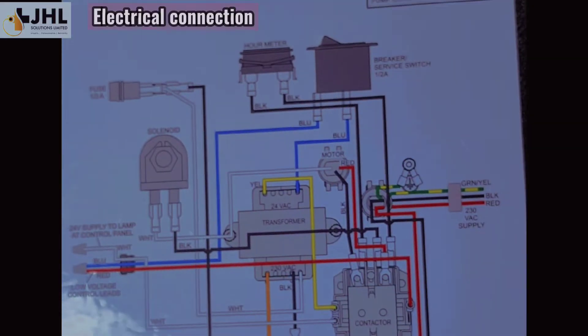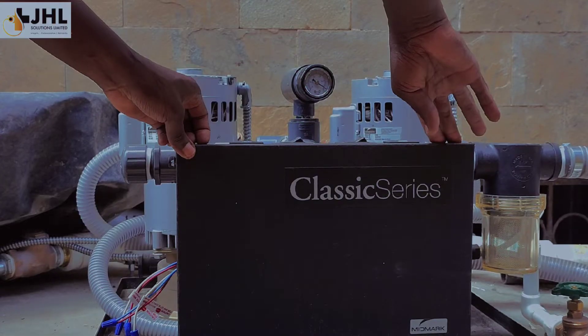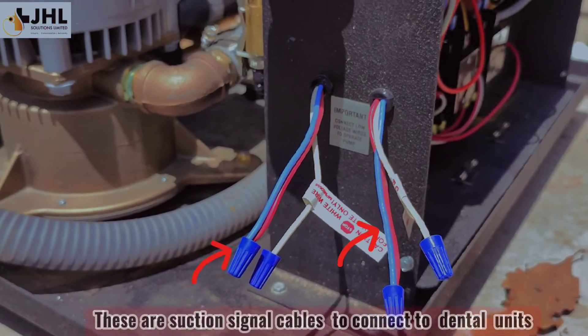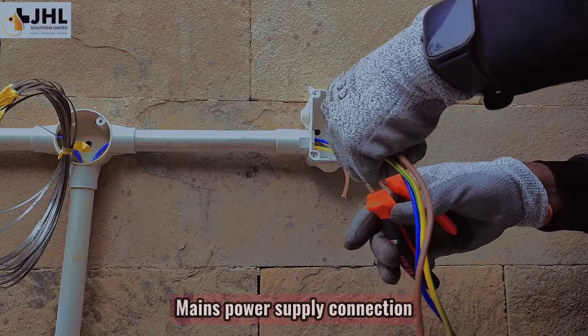The control box contains two independent circuit diagrams for each pump. Note, this wiring is from the manufacturer. These are suction signal cables to connect to the dental units. Main power supply connection.